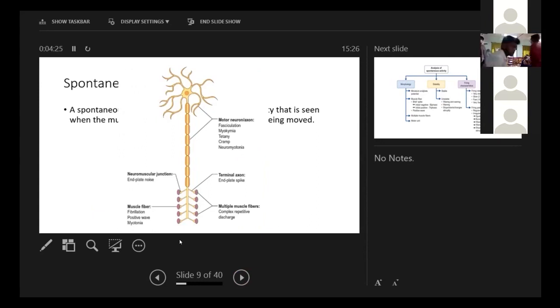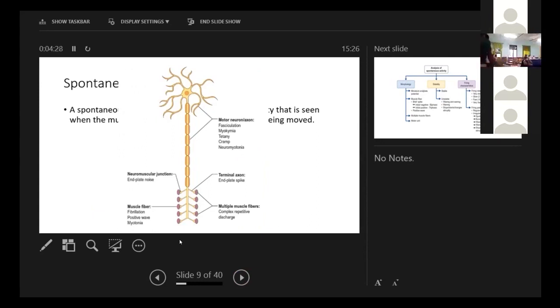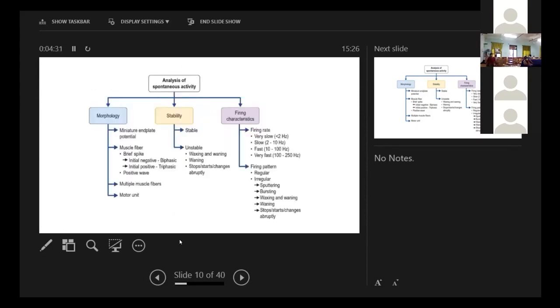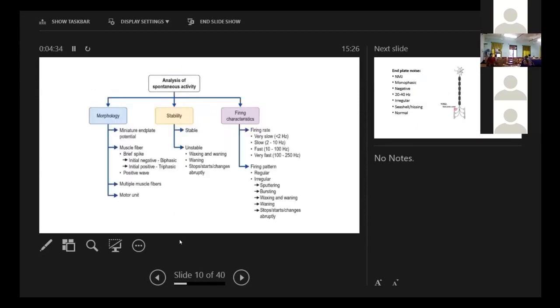I'm not going into the details because of shortage of time. We'll just show the spontaneous activity and how does it look on the screen. So how to analyze this? We do this based on the morphology, stability and the firing characteristics.